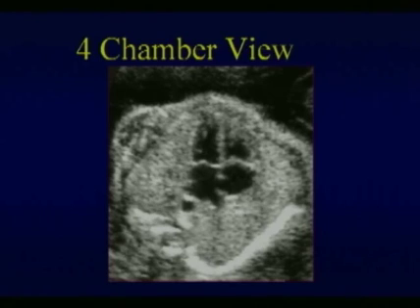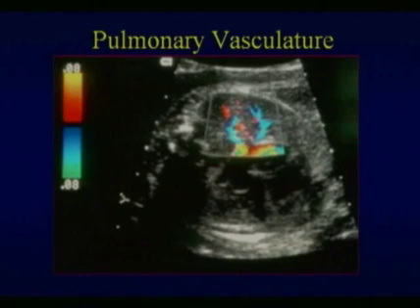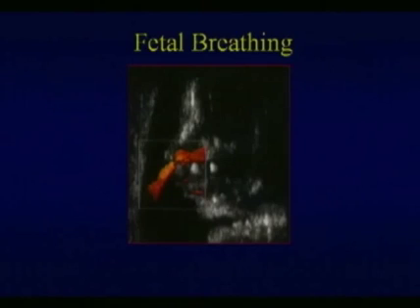We can easily see the echo texture as well as the volume of the lungs and ascertain that they appear normal. We can also look at the vascularity, although that is not as helpful as simply looking at the image alone, but can be helpful in complications. We can see the airway in different ways.